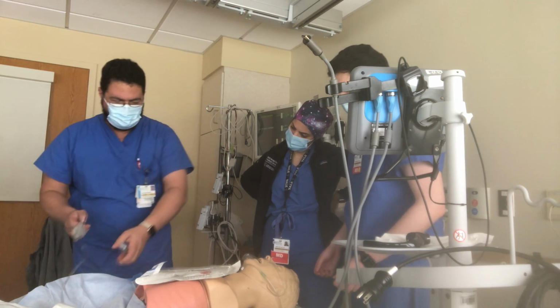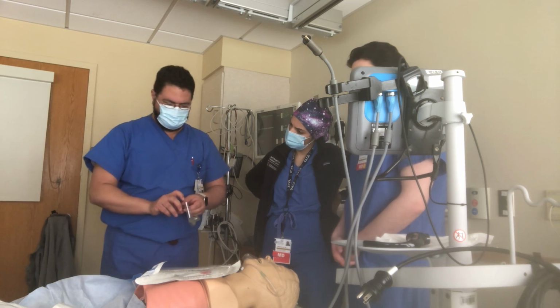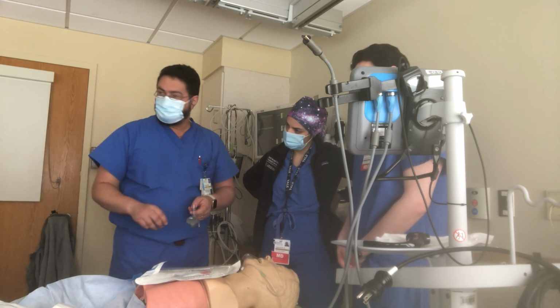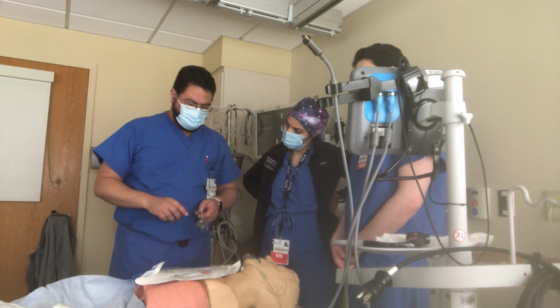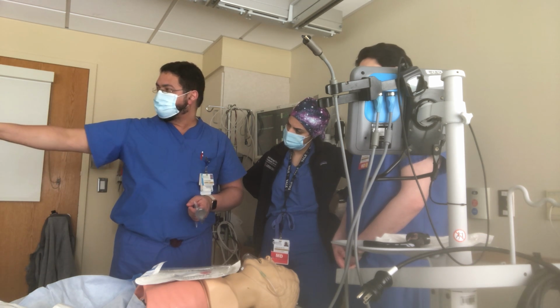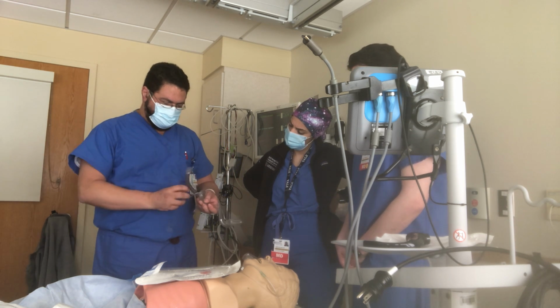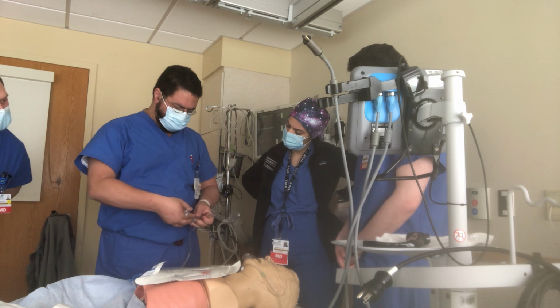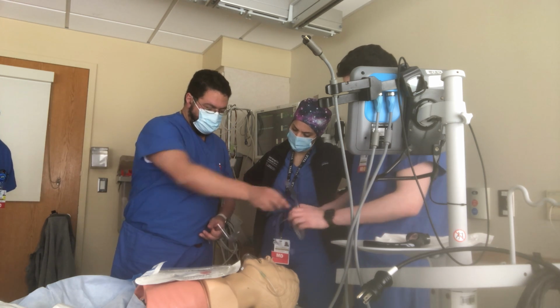What you do with this, you know how the regular LMA, can I have the regular LMA? Yeah. Or actually, there's an LMA open here somewhere. Yeah, right there. The regular LMA, just anyone. Here, you go like this. Put your finger under the bell like this, the nails, and you go here.